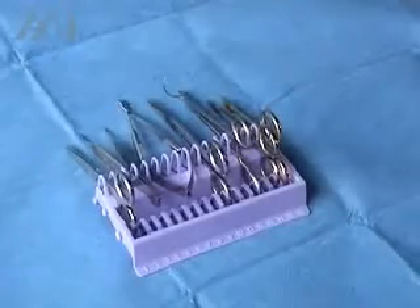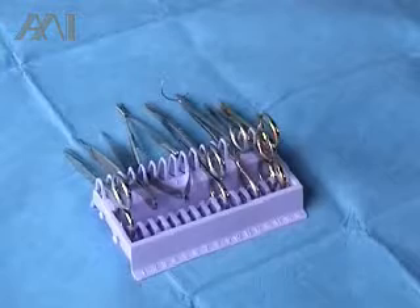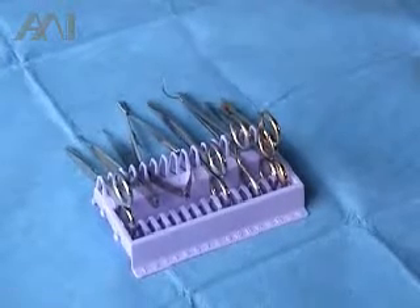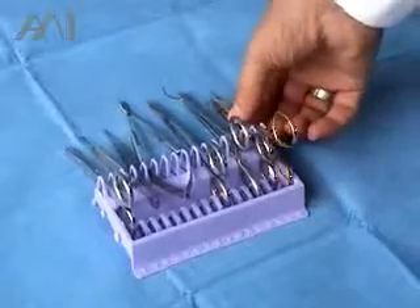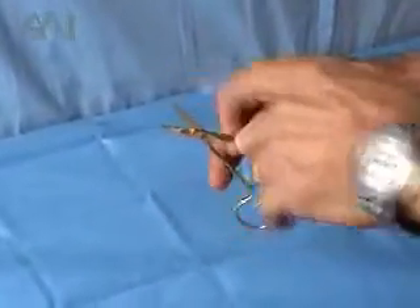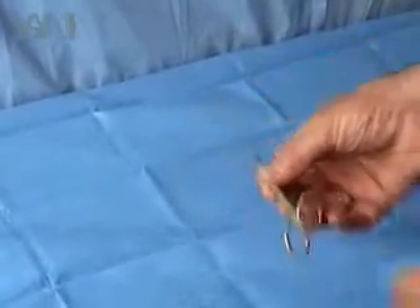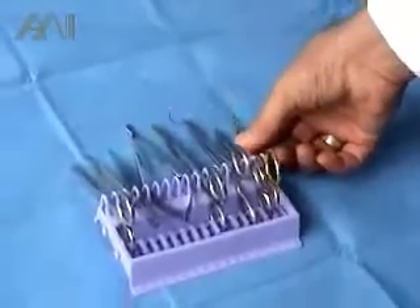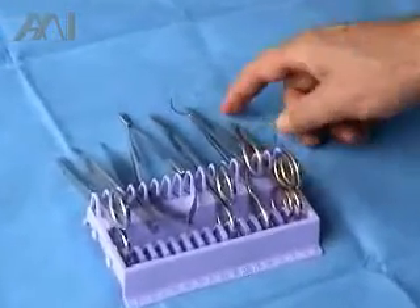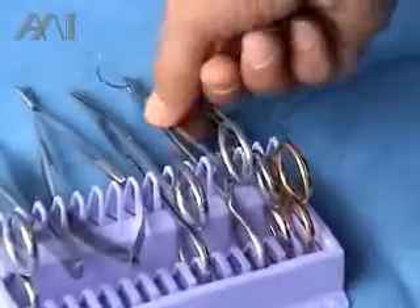Another feature of the instrument organizer is to control sharps in surgery on the Mayo tray and back table. As an example, an iris scissor that has very sharp front and jaws can be put safely on the instrument organizer with the tips pointing down and away from the user.